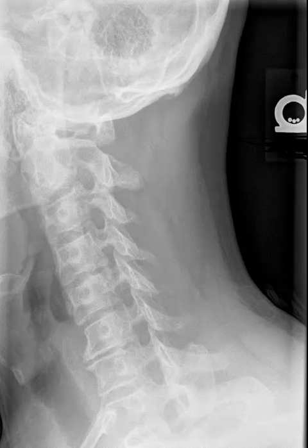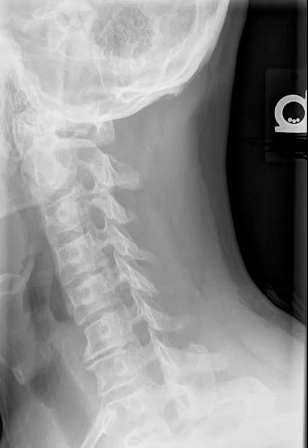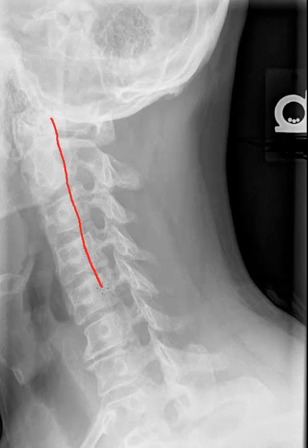This is more relevant in question-and-answer situations. When you're looking at cervical spine oblique projections and the clinician did not use a marker specifying whether it was an anterior or posterior oblique, you can simply deduce which side of the patient is correct. If you pay close attention to the radiograph on the right-hand side, you'll notice there's a left marker on the radiograph. There's a quick trick you can use: draw a line dividing the mid to posterior aspect of the vertebral body. The visualization of this line will allow you to separate right from left sided structures.